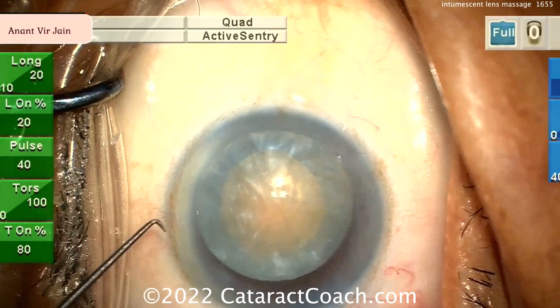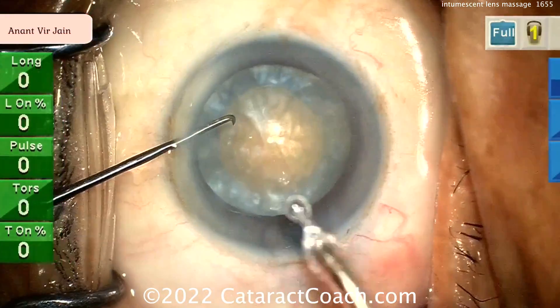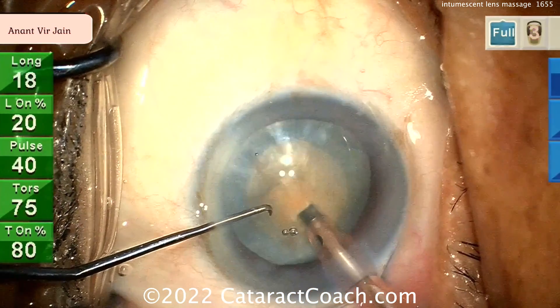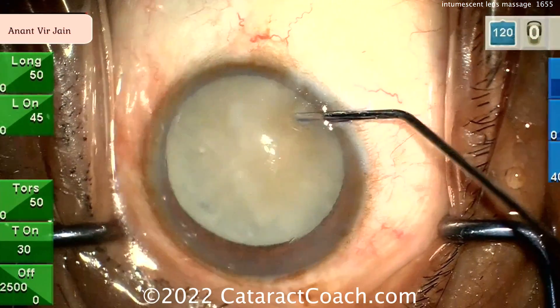Probably phaco chop — good job, nice chopper there. Maybe a vertical chop, combo chop, something of that nature. Going with the phaco probe here. I like the incision too, by the way. Maybe a stop and chop. There you go. Let's go to the next case.